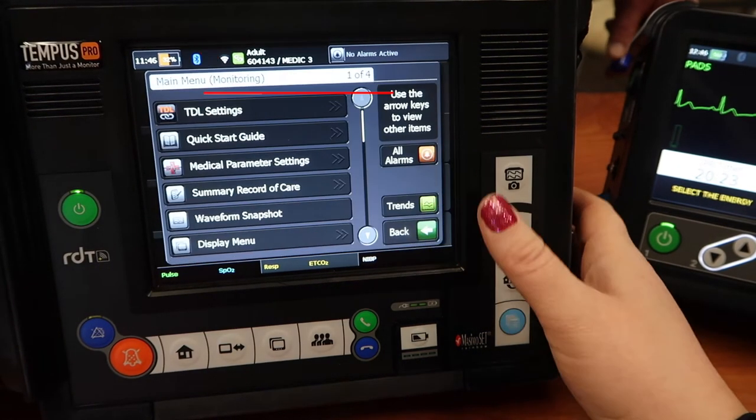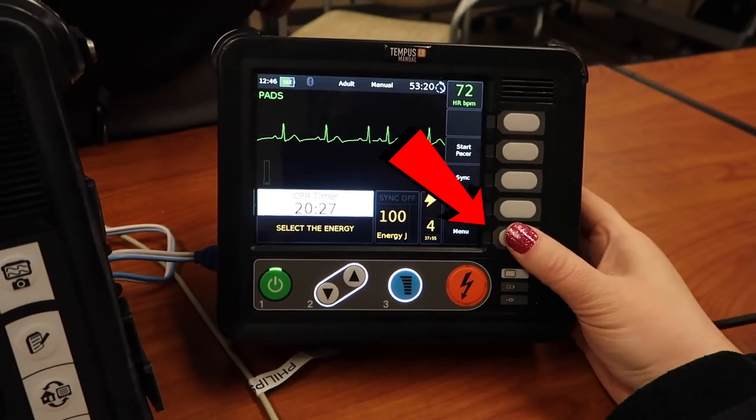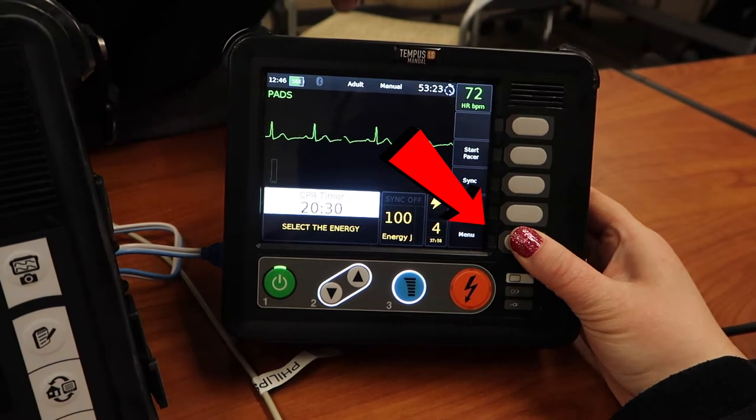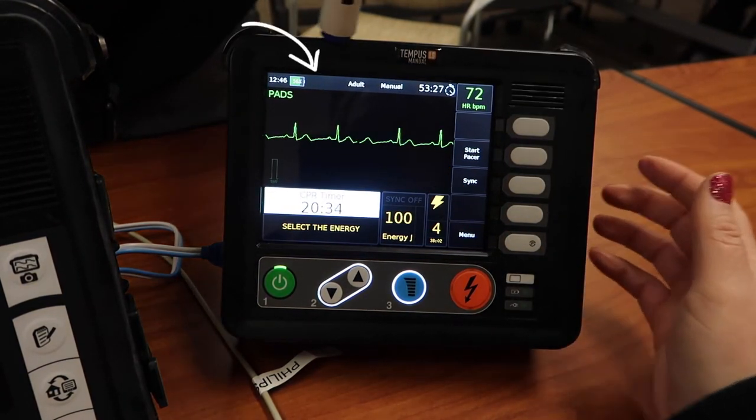Then I'm going to go over to the defibrillator that I want to connect it with, and I press that menu button as well and hold it down. If you take a look in that left-hand corner, there's the blinking Bluetooth light, and if you look on the cardiac monitor it's doing the same.